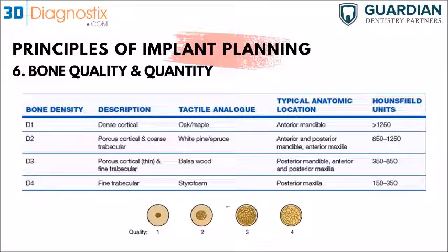So what you should also look for is the density of the bone, and that is going to give you an idea of how the procedure could be done, whether you need to do some bone expansion, densification, or an underprepped osteotomy. It gives you an idea of how the bone would look using the software before you go in and do it physically or clinically.